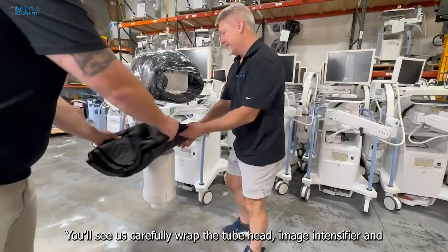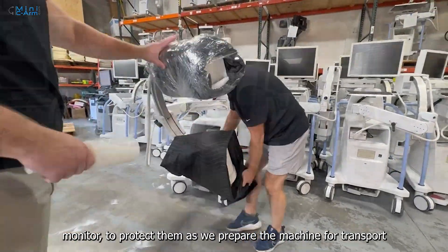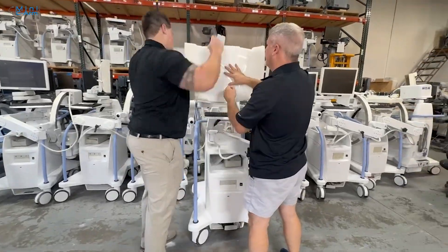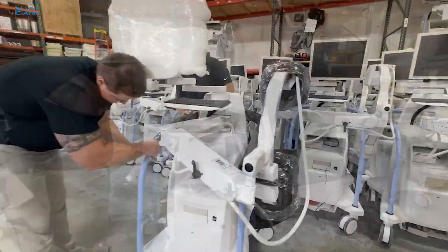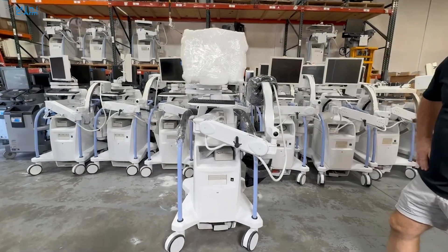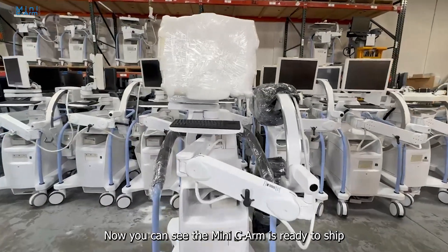You'll see us carefully wrap the tubehead, image intensifier, and monitor to protect them as we prepare the machine for transport. Now you can see that the MiniCArm is ready to ship.